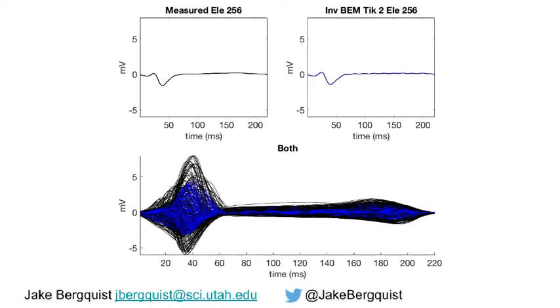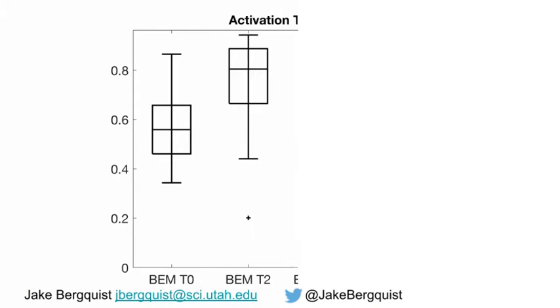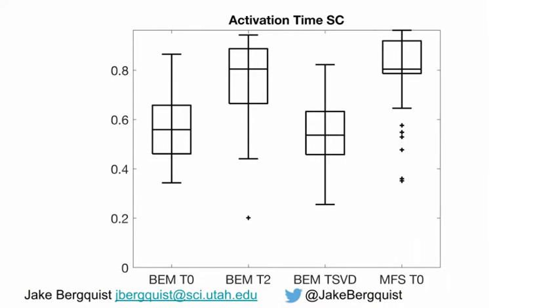After examining the metrics of spatial and temporal correlation and RMSE, we thought it would be best to also explore some metrics that capture other features of the inverse reconstructed signals. The first of those is spatial correlation of activation maps computed on both the measured and inverse reconstructed potentials. In all of these metrics, it is interesting to notice how Tikhonov's second order with boundary element method and MFS with Tikhonov's zero order perform similarly when compared to the other two methods.